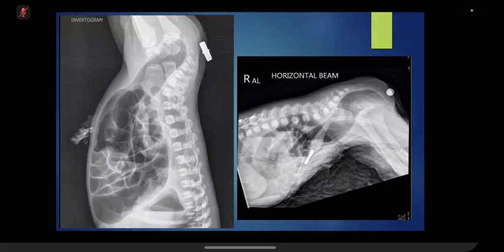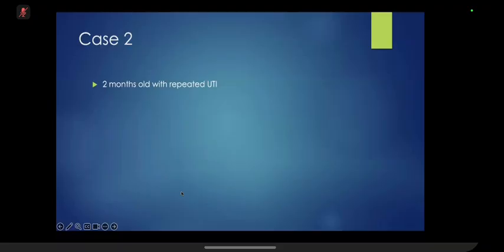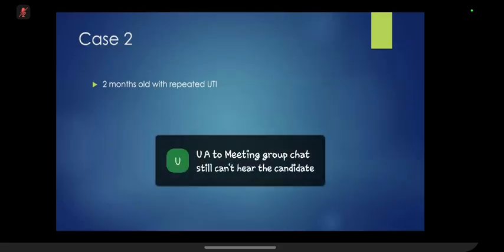Okay, so candidate 1, let's move to the next case. Are you ready? Yes. Okay, case number 2. A 2-month-old with repeated UTI. So I will just click play on the video.